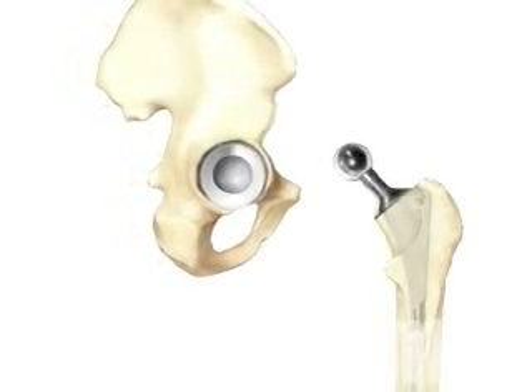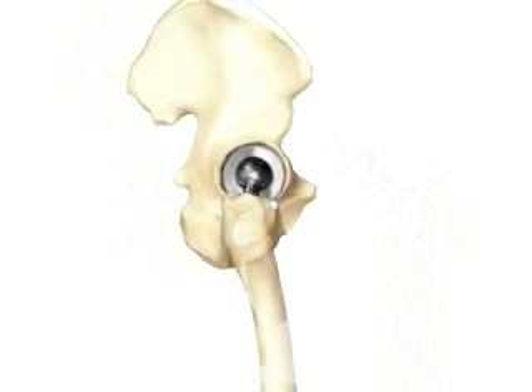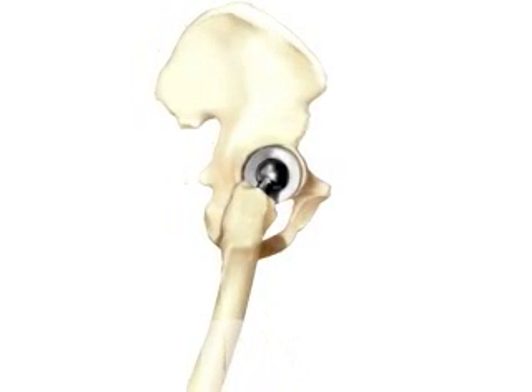The artificial ball joint is turned inward and fit into the socket. The team carefully checks to make sure that it fits and allows the full range of normal motion.